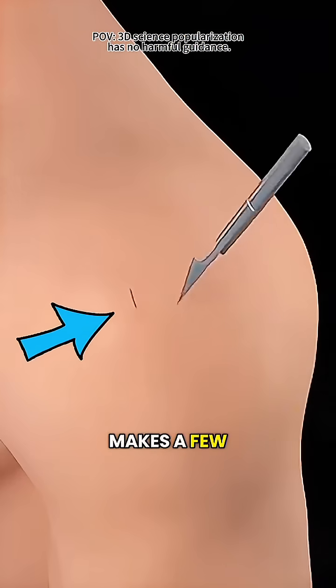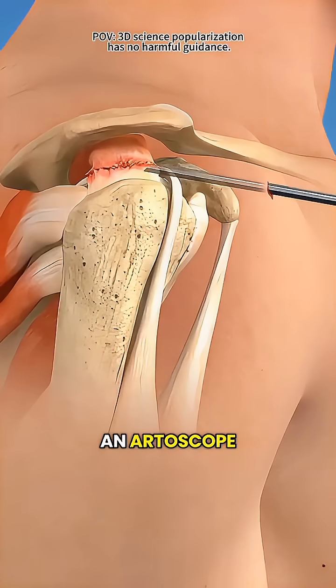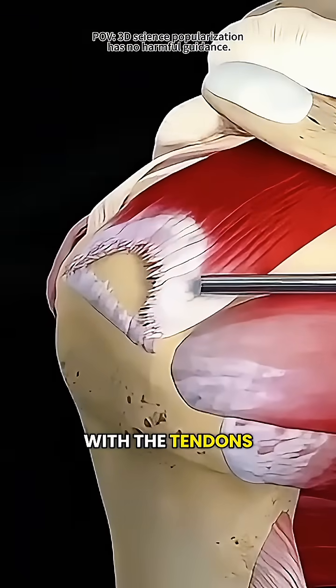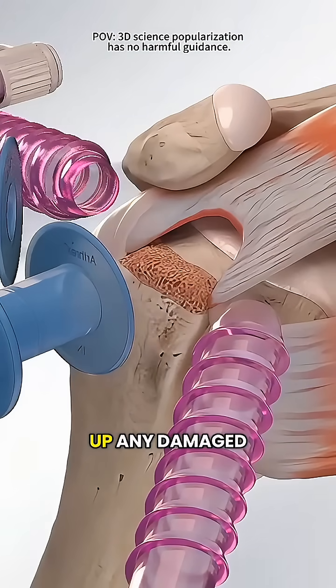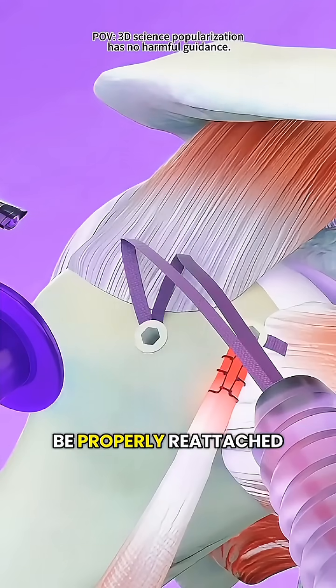First, the doctor makes a few small incisions in your shoulder, then uses a tiny camera called an arthroscope — kind of like a little flashlight — to see exactly what's going on with the tendons. Once they locate the tear, they use specialized tools to clean up any damaged tissue and lightly prepare the bone so the tendon can be properly reattached.